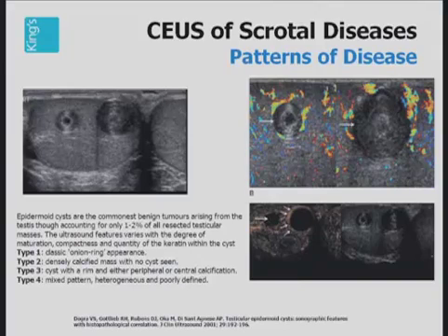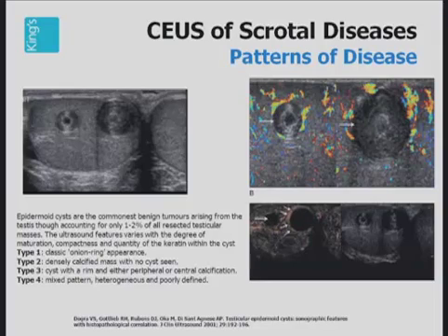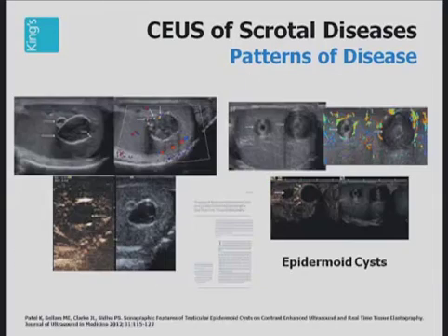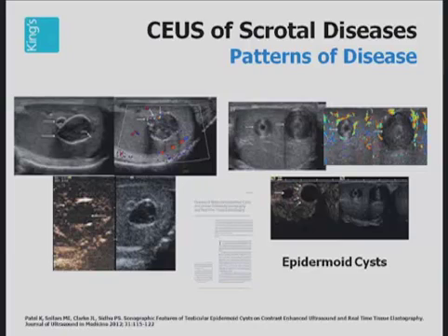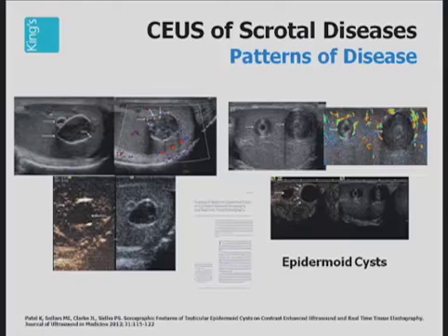In this case, there is increased enhancement around the periphery of the lesion — not because of inflammatory change, but due to compression of the surrounding testicular parenchyma. Compare this to the example of an atypical epidermoid cyst, where there is calcification of the rim and no vascularity within the central aspect. This too is an epidermoid cyst. The complete absence of vascularity within this lesion allowed for a targeted excision biopsy rather than subjecting the patient to a total orchidectomy.